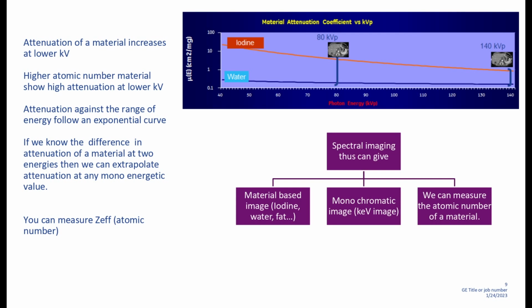There are many articles. Even Dr. Dushan Sahani was the first person who clearly commented that abdominal lesions are seen well at 68 keV. There is a publication also that we have done in Asia. So it depends on the institute how they are seeing things. More or less it will default to that value.